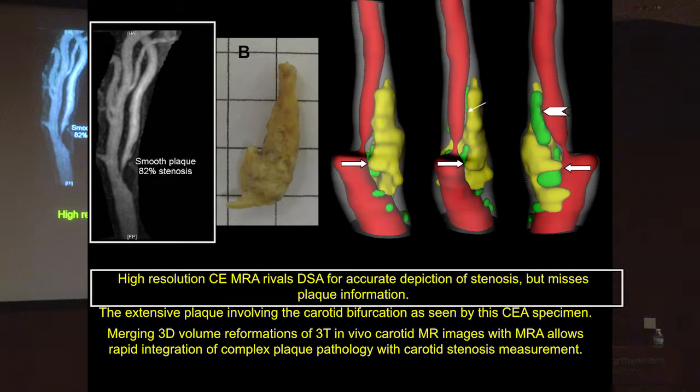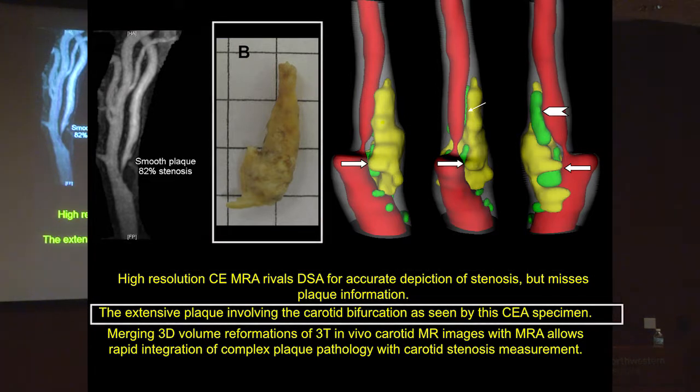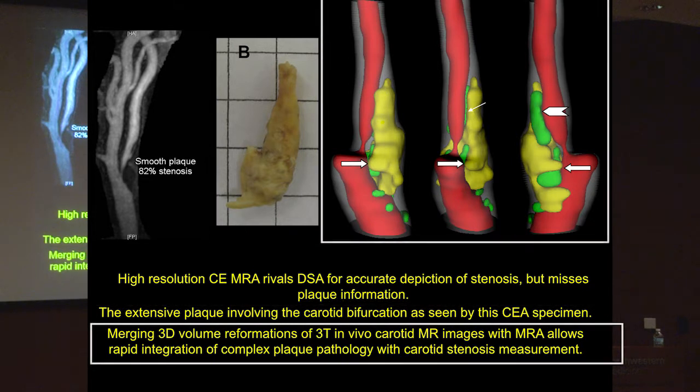So of course, as imagers, this is what we think of as carotid stenosis. This is what vascular surgeons think of as carotid stenosis, and the surgeon I worked with the most excised the specimen completely intact. And one of the first questions he asked me is, can you make your luminal images look like what I think of to help me plan where I'm going to be doing my incision? So one of the first things we developed was simple volume rendering of the 2D imaging that we were getting of the plaque.